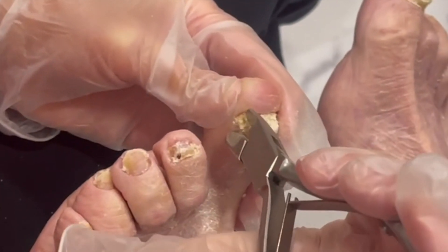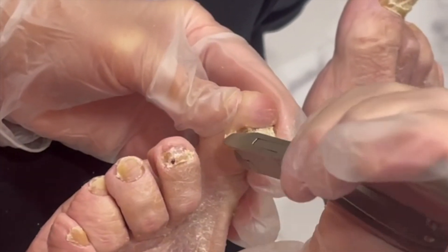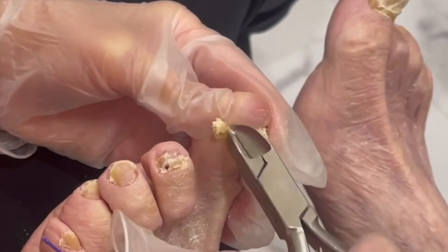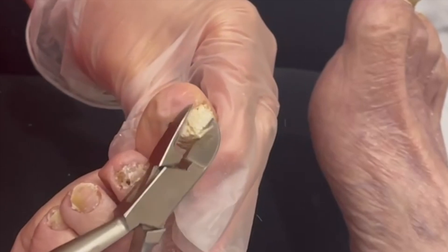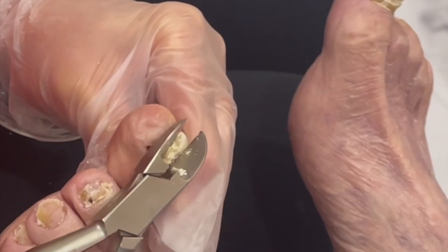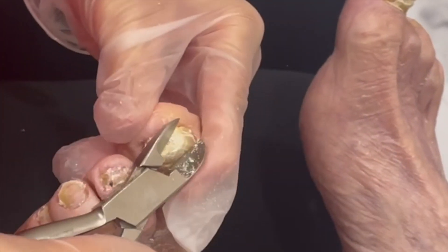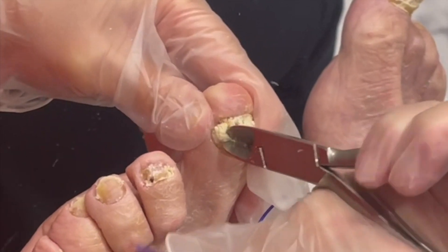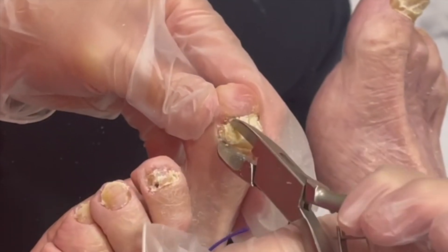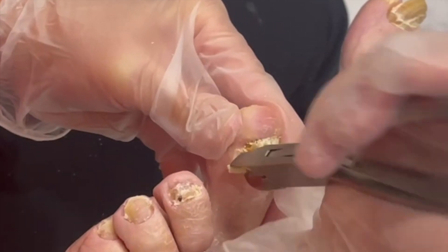Are you okay? Yeah. Okay. I know sometimes there's a lot of pressure that goes with it. There's all of this stuff that accumulates under there and it actually can cause the nail to be a little bit loose.